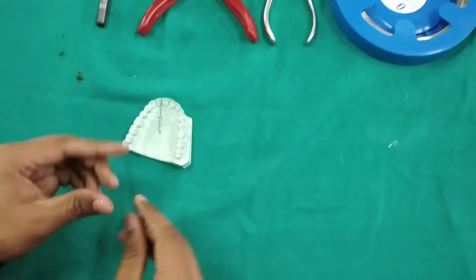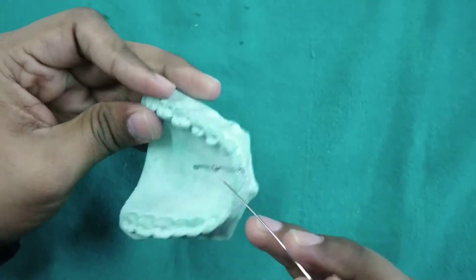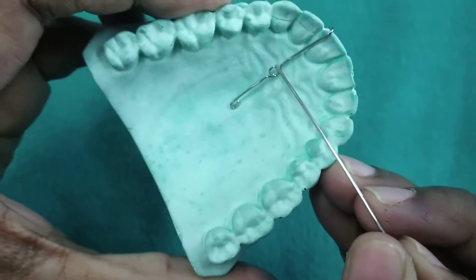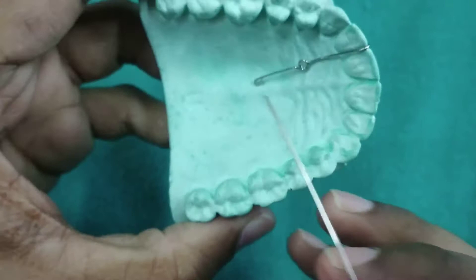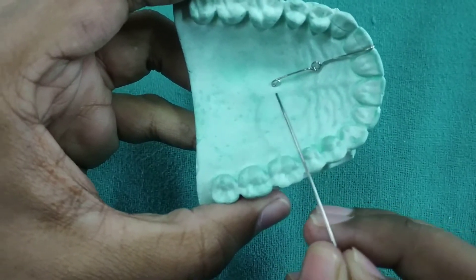The parts of a finger spring are a helix of a diameter 3 mm, an active arm 12 to 15 mm long, a retentive arm of about 4 to 5 mm long, and a retentive tag.